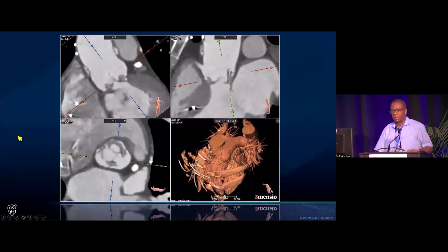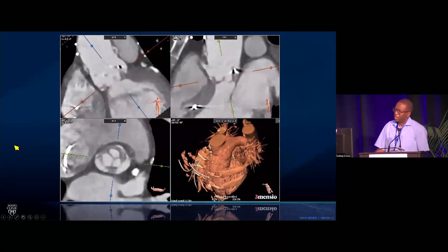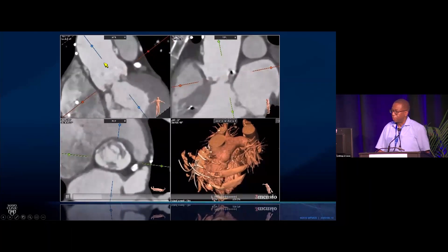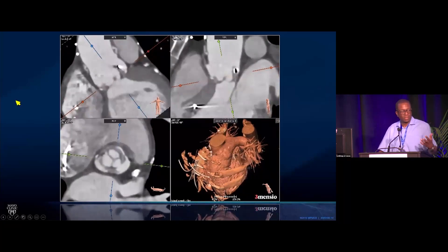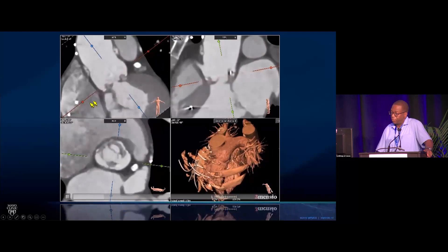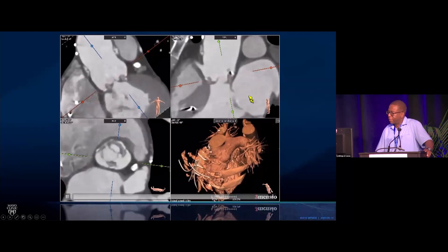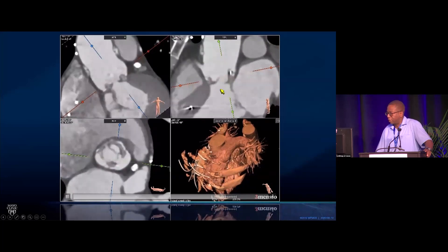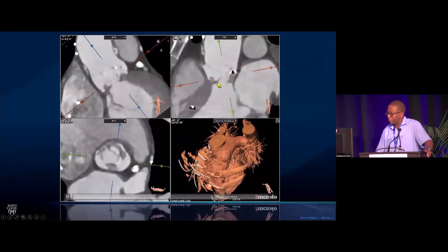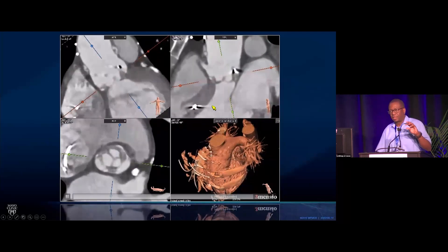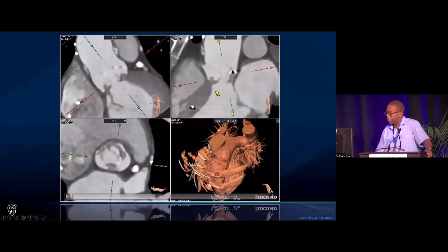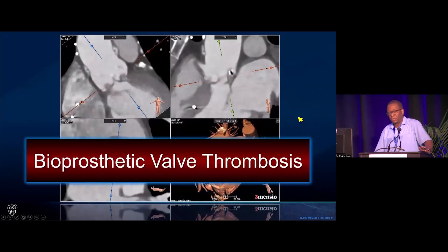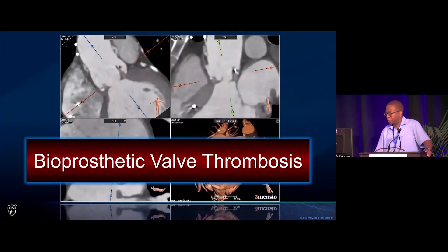The next step — you could get a transesophageal echocardiogram, which we do routinely in some of these patients. But we've pivoted to cardiac CT because cardiac CT has a really good look at the aortic valve. When you're looking at mitral prosthesis or tricuspid prosthesis, a transesophageal echo is good, but for the aortic valve prosthesis we've really pivoted to using cardiac CT. What you see on cardiac CT is hypoattenuating leaflet thickening or hypoattenuating lesions on the aortic valve cusps, usually at the base of the cusps — thickening and darkening consistent with a layer of thrombus — and restricted leaflet mobility as well. The patient was diagnosed with bioprosthetic valve thrombosis — completely asymptomatic, but we saw a change in hemodynamics across the valve.